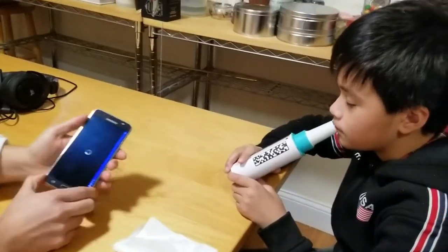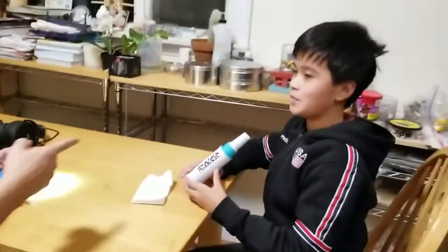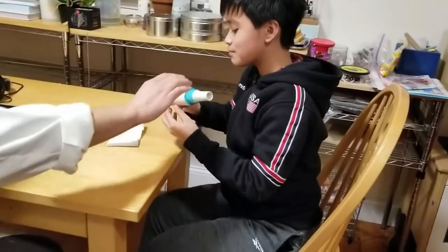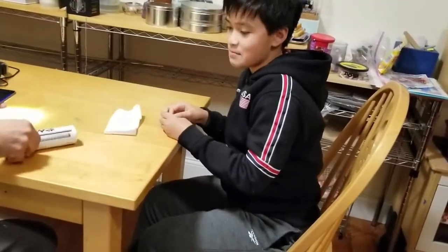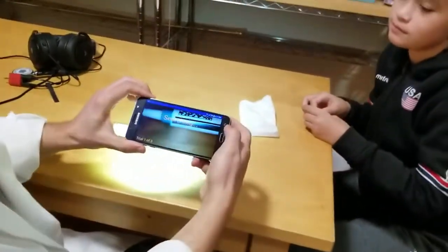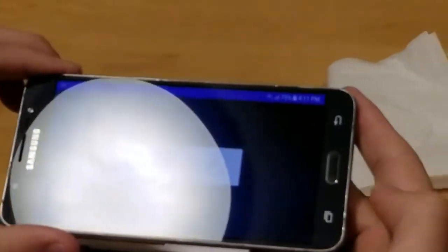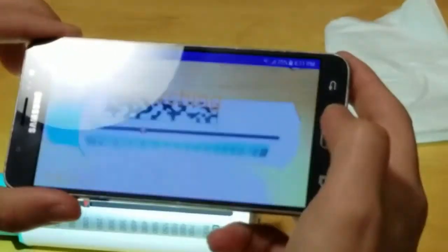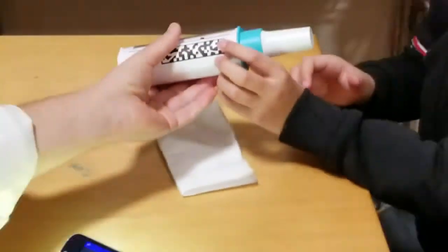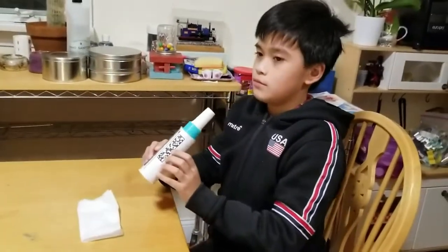Click start. So go ahead and take a deep breath, sit up straight, and now blow into the meter. Okay, and please hand it to me. Okay. Now we're going to record the reading. Okay. And then we're going to do it again. Okay. Go ahead. Reset it. Take a deep breath and then blow.